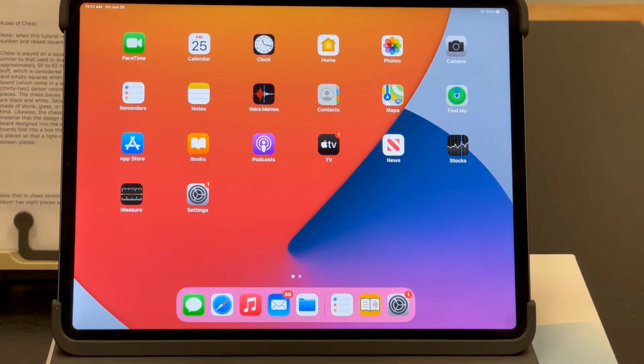This is an introduction to the iOS Magnifier utility. The iOS Magnifier is a terrific tool that can allow a person to use their iPhone or iPad as a video magnifier for close-up and distance tasks. For some people, their iPhone or iPad might serve them well as a substitute for both a hand magnifier or portable video magnifier and a monocular or other distance device.